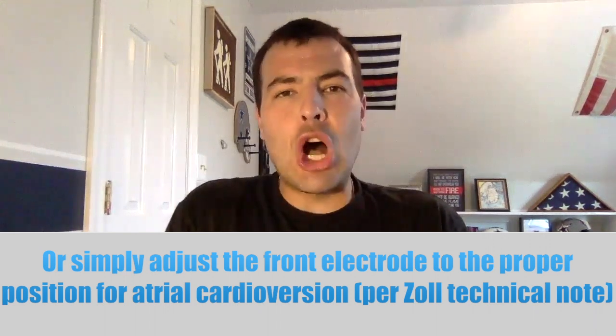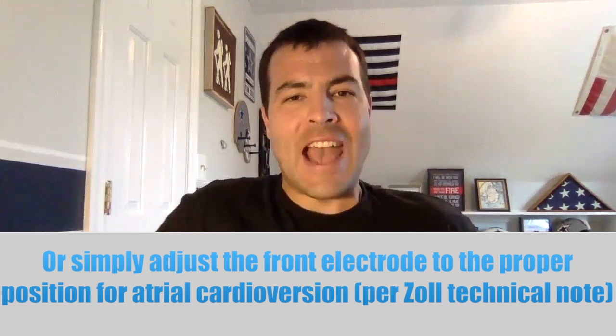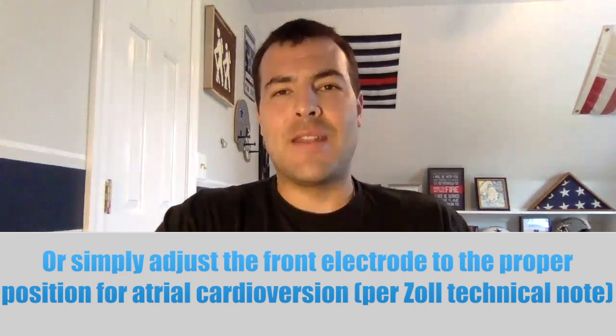In addition, for those of you working in systems where dual sequential and double simultaneous defibrillation are an option for refractory ventricular rhythms, you will now be able to apply that second set of pads in the apex lateral and sternum configuration without having to log roll your patient to get to their back. If ventricular cardioversion becomes necessary, you are still in an ideal configuration. If atrial cardioversion becomes necessary, you can apply another set of pads as indicated in that Zoll technical note, and you won't have to log roll the patient — you'll have access to their entire front to get that in place.